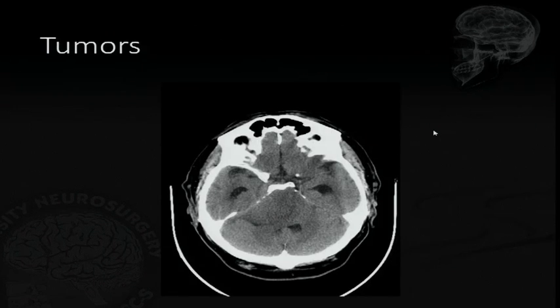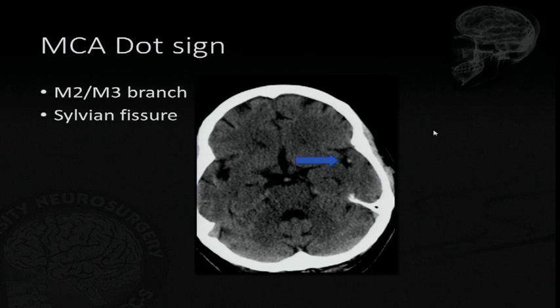So, Hugo, can you go back? Look at the basilar artery there. It's also hyperdense. Sometimes the vessels are hyperdense. We still get the CTA, and then you'll know if it's actually occluded or not. Depending on how much beam hardening artifact you have, the basilar artery looks hyperdense a lot of the times. But we always get that CTA. That's why we always get that CTA. So we're not basing on this.